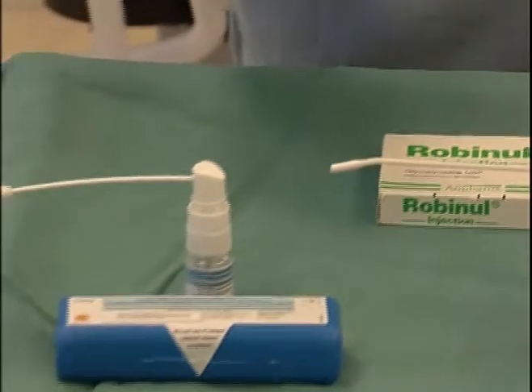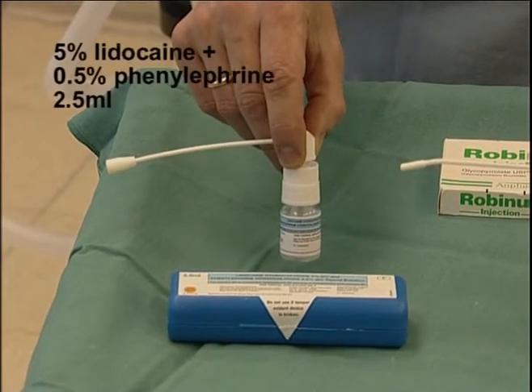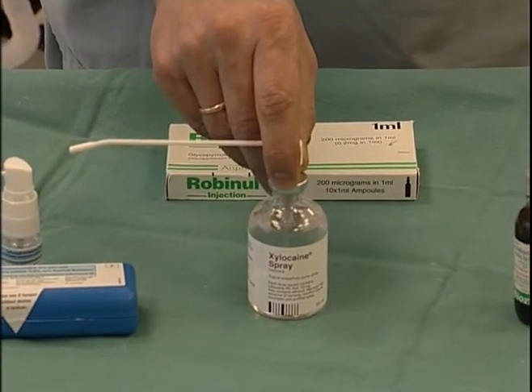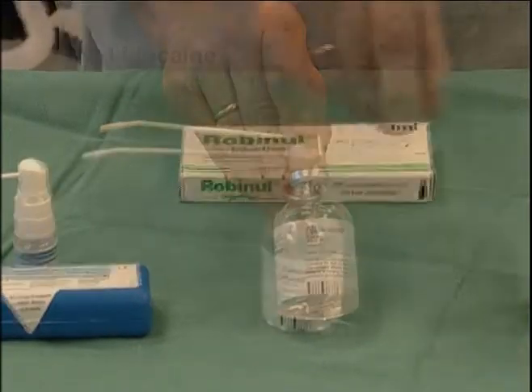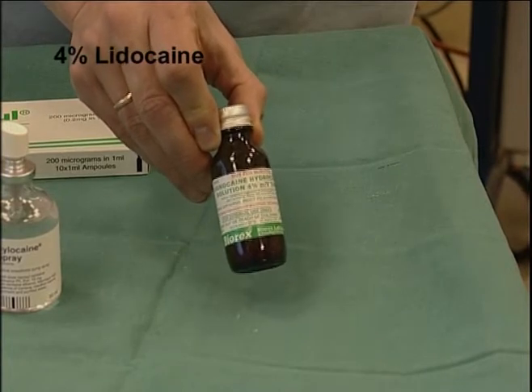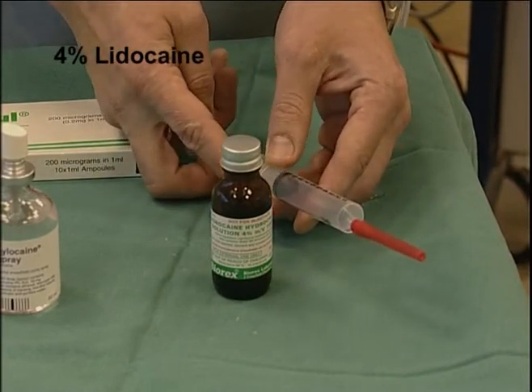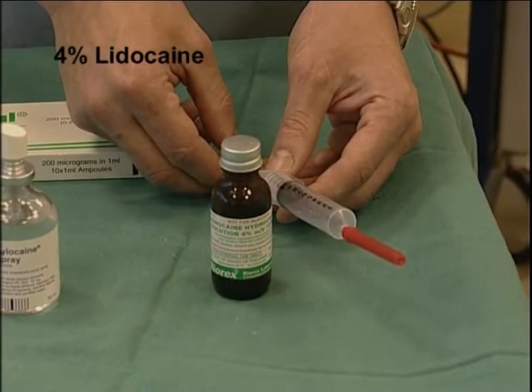After you have identified which nostril you are going to use, you need to anaesthetize that nostril. We suggest using a combination of 5% lignocaine and 0.5% phenylephrine, which comes in a 2.5 mL vial. The oropharynx also needs to be anaesthetized to obtund the gag reflex, using 10% lignocaine. For the spray-as-you-go principle, we recommend 4% topical lignocaine: draw up 1 mL into a 10 mL syringe, then draw 9 to 10 mL of air, so that the air propels the solution to the end of the scope.